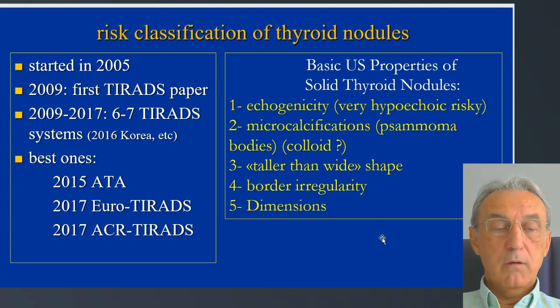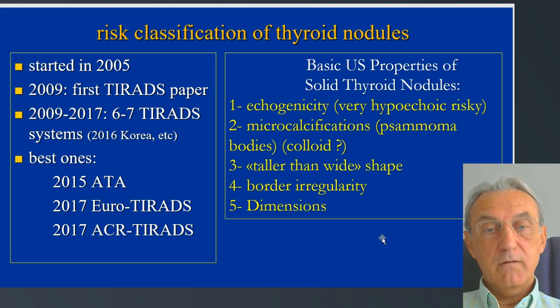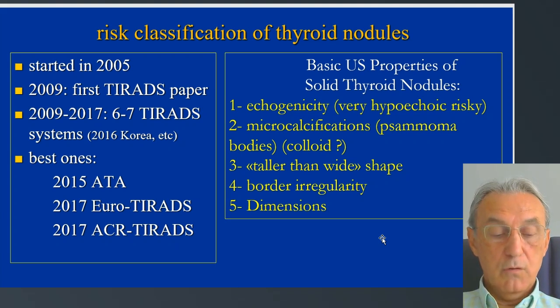Which are in use now, which are most popular? Yes, the ATA criteria or guidelines and the ACR TI-RADS guidelines are the most used, most popular ones.